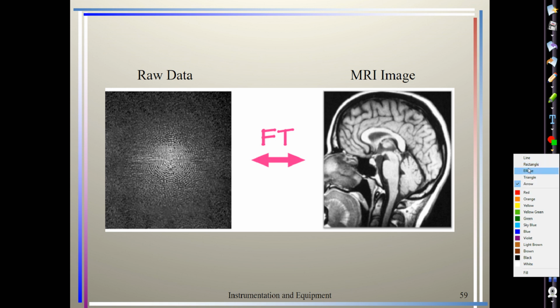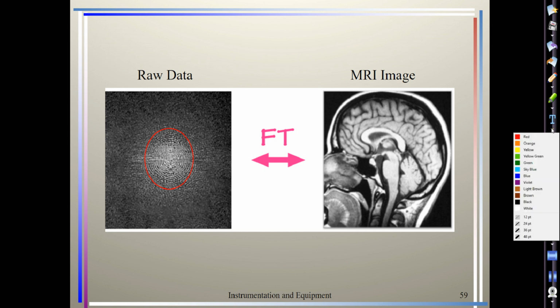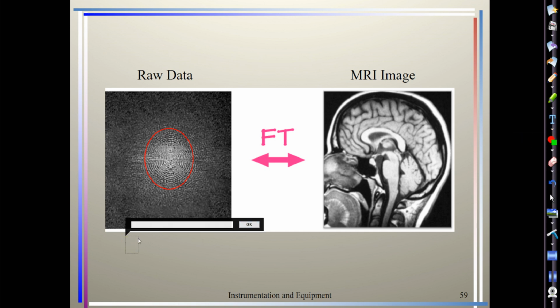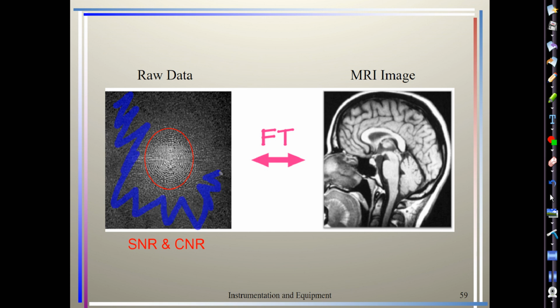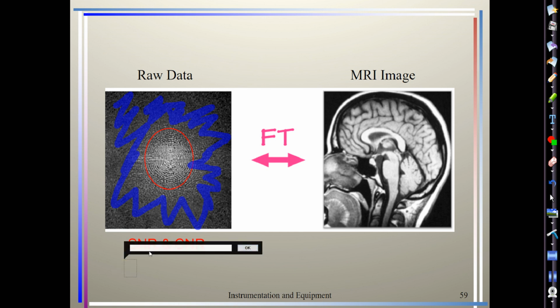So here in the middle of K-space, the red is going to be our SNR and our contrast. And then everything on the outside here, that's going to be our spatial resolution.